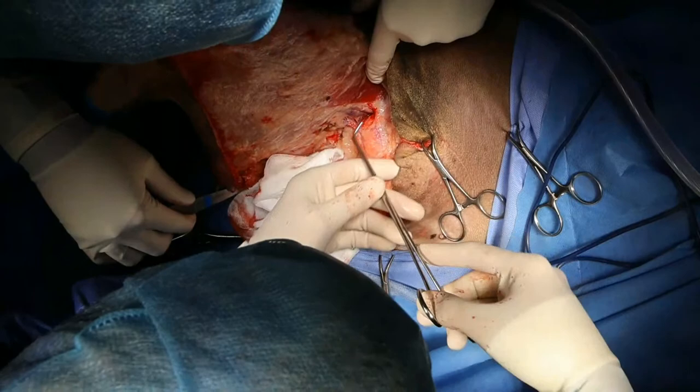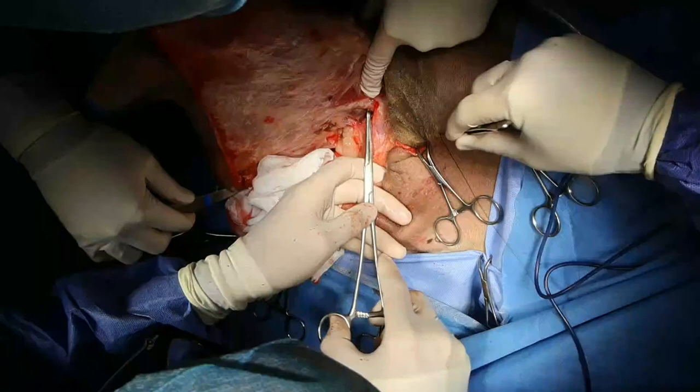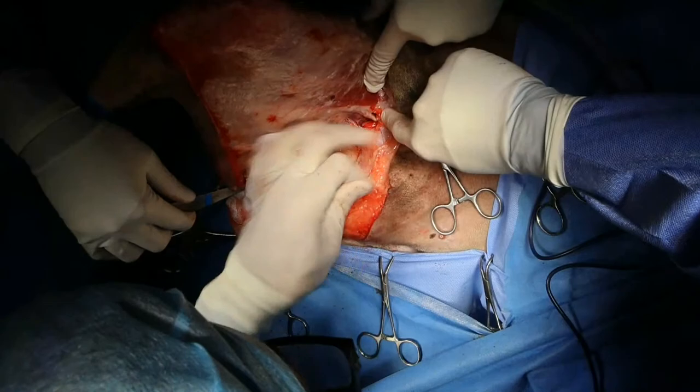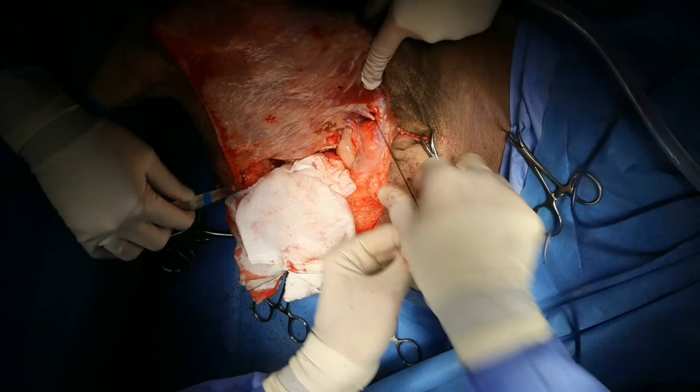Okay, so I'm around that huge femoral artery right there, which is about the size of a Sharpie. And I'll get some 2-OPDS to transfix it. I'll keep holding on to that.